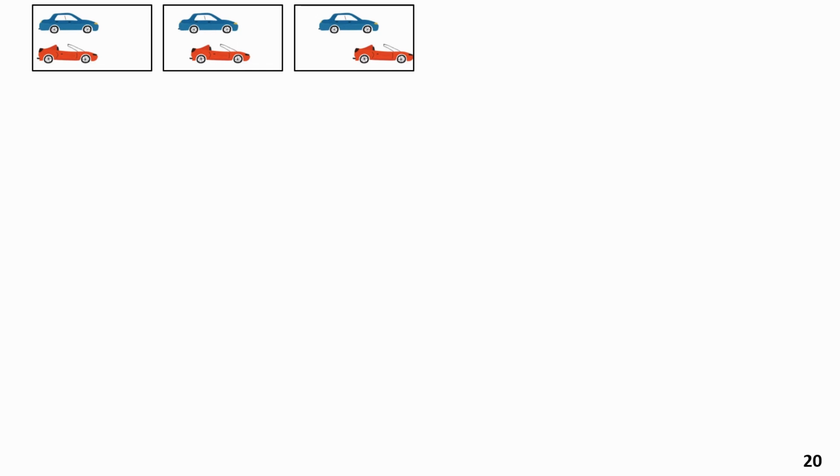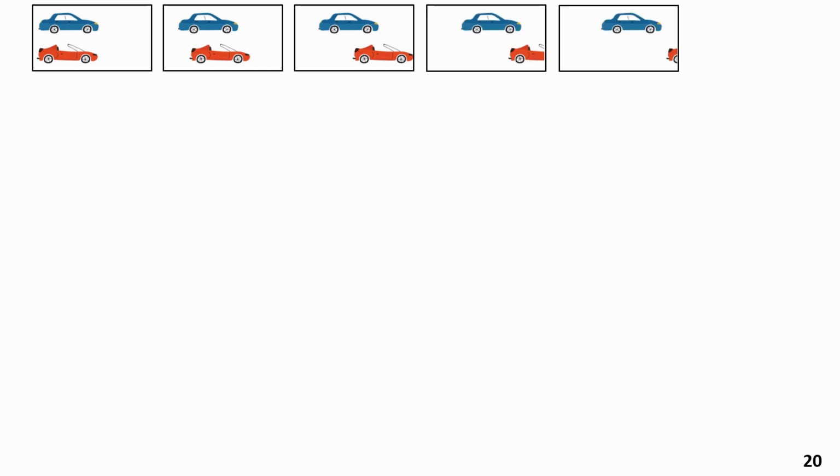Let's take a look at frequency encoding and phase encoding from the perspective of making a video from photographs taken one after another. If we have 2 cars at the starting line and we use a camera to take pictures at regular time intervals, then these photographs will capture the position of the 2 cars as time passes, right?